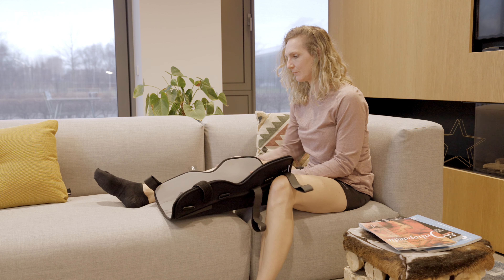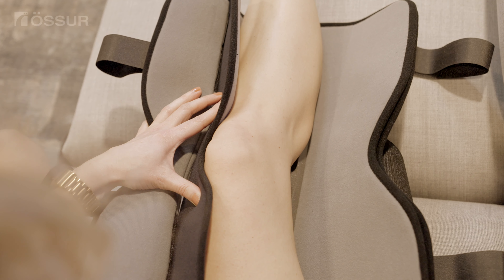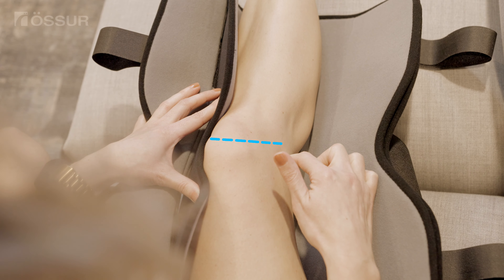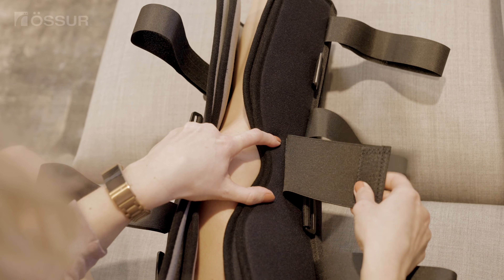Carefully lift up the leg and place the brace underneath. Center the leg on the rear stay. Ensure the kneecap is located in line with the notch at the center of the brace. Close the brace so that it surrounds the knee and the opening is over the kneecap.